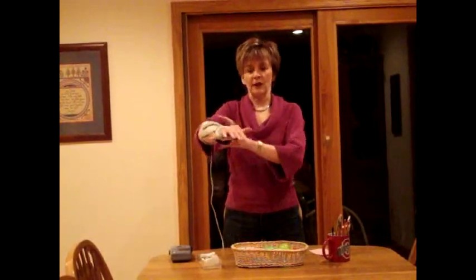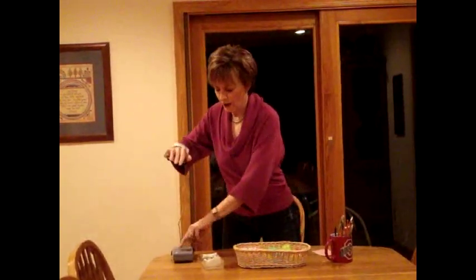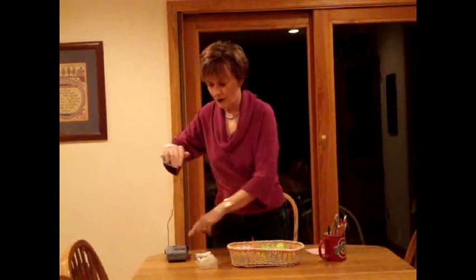After I got the Bioness machine, you put it on, and they come in different sizes, small, medium, and large, and a technician will fit it to your hand. So when you turn it on, it opens and closes your hand. And like I said, it takes repetition for the brains to reroute. So you turn it on, and like it's opening my hand right now. I'm not doing anything. It's the electric stimulation that's opening up my hand.